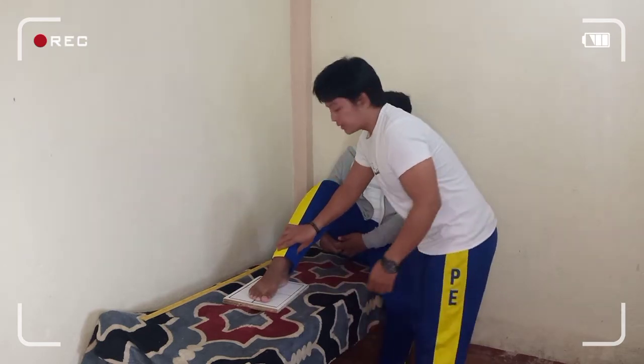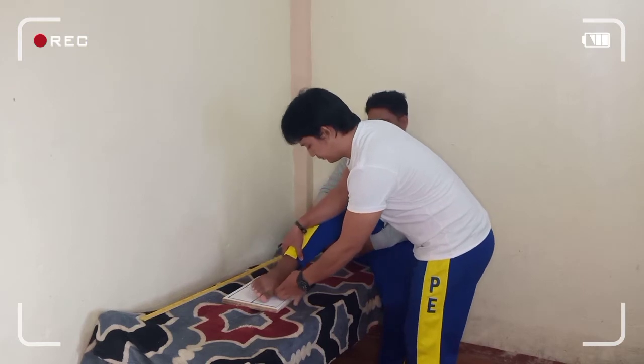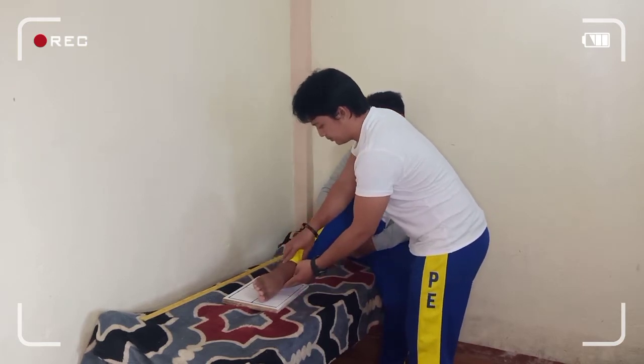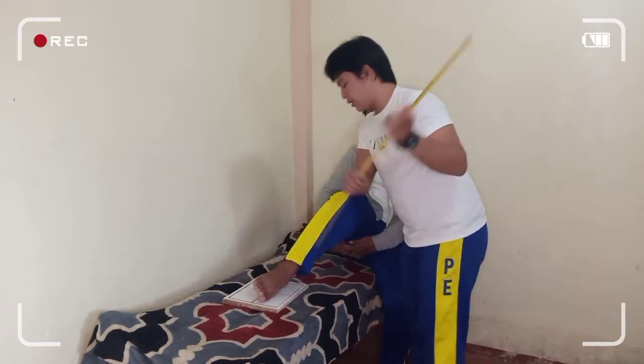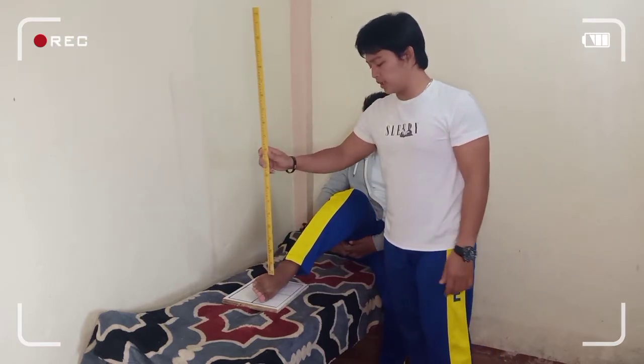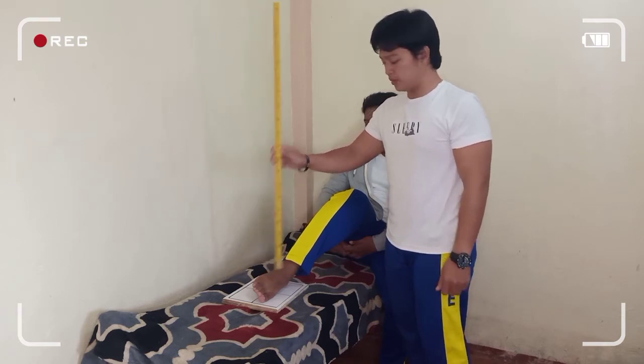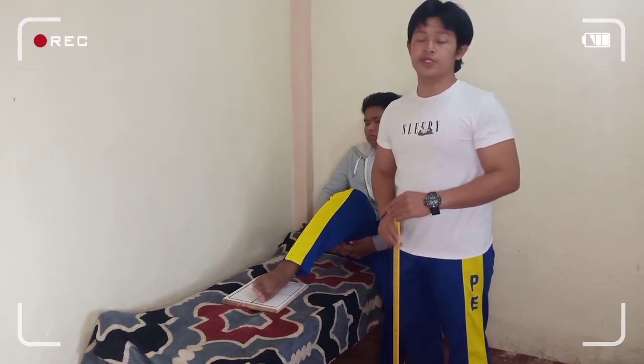Rotate the foot 30 degrees internally, and the central ray must be perpendicularly directed to the third metatarsal. The structures shown in this projection are the interspaces of the cuboid, calcaneus, and the fourth and fifth metatarsals.